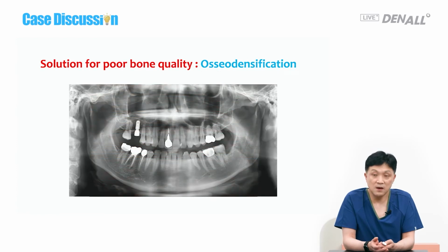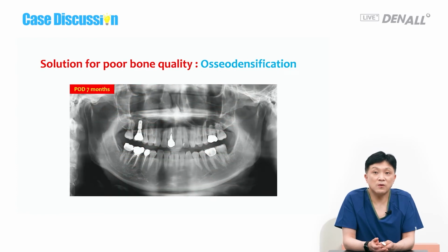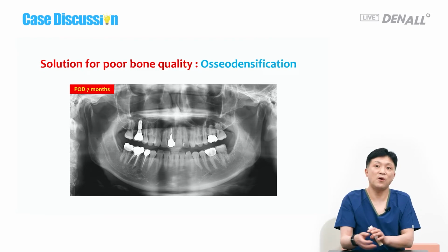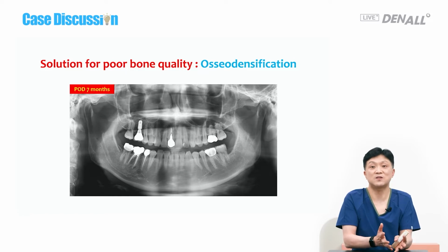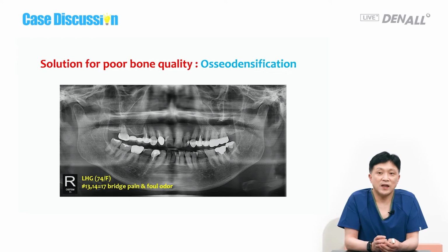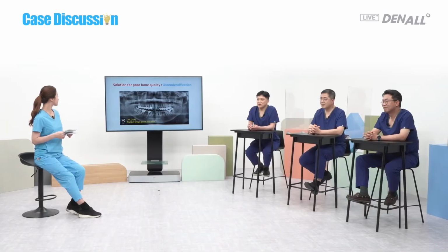Second surgery, post-op 7 months. Compared to other densification methods, this requires more time. The outcome is more or less the same. So that's how it goes. In this patient, I used the Densabur, which is a very trendy, hot topic these days. I was wondering what is so marvelous about that. I bought and used it, and it's very expensive.